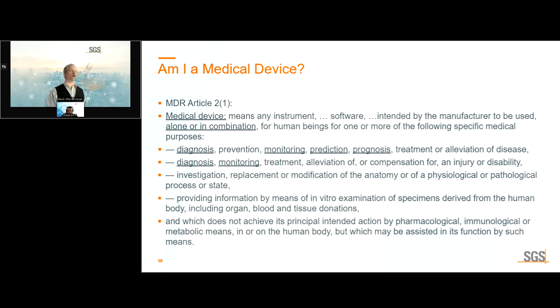Very frequently, they are diagnosis, monitoring, prediction, and prognosis. Software by itself doesn't typically treat, although it can for certain disease states or disabilities, particularly ones that involve mental disabilities, which are considered to be treatment for many softwares. So when we're looking at your device, we need to understand, what do you diagnose, what do you monitor, what do you predict, and what do you prognose?